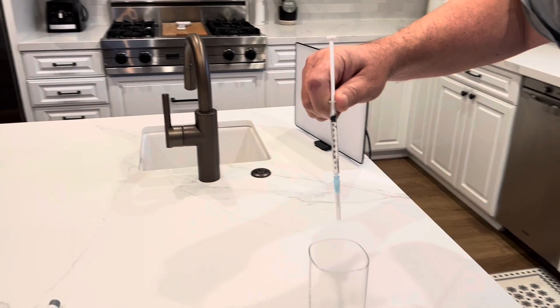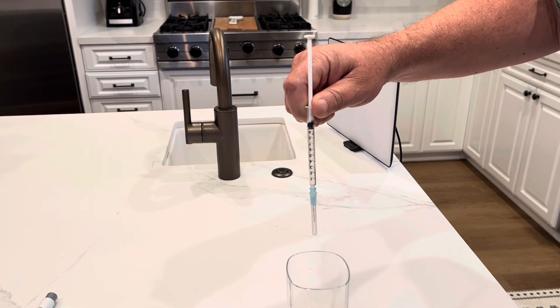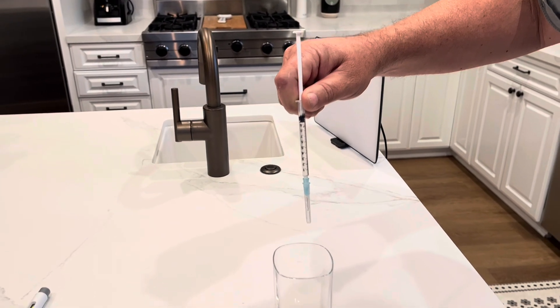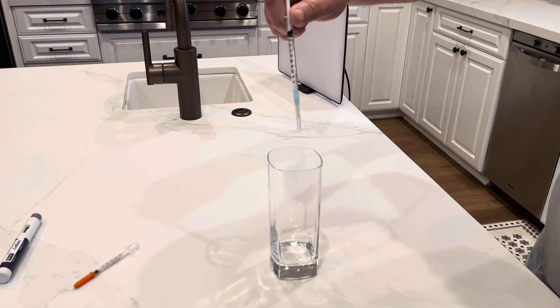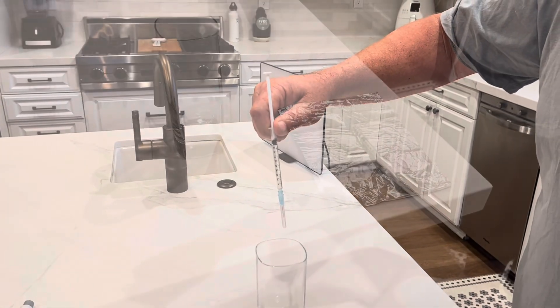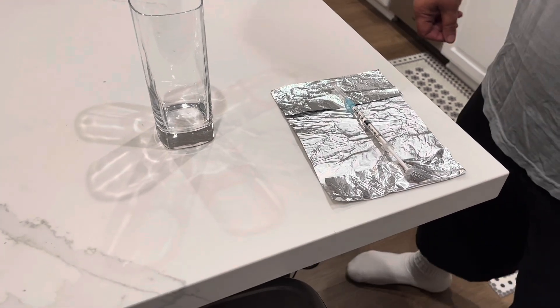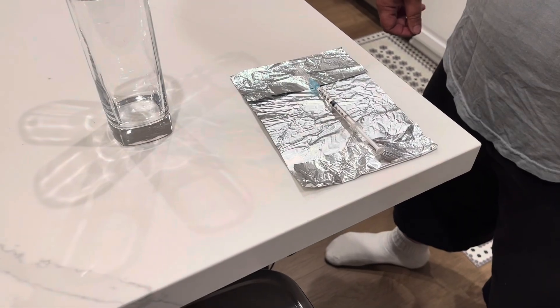A best practice we discovered is to let the foam settle before attempting to reinstall the plunger. So after you inject into the TB syringe, place it in a glass for a minute and let the foam settle, and then put the plunger in. The TB syringe is a little bit too big to fit back in the Ozempic box, so we need to keep it in the dark — the idea is to wrap it in aluminum foil.